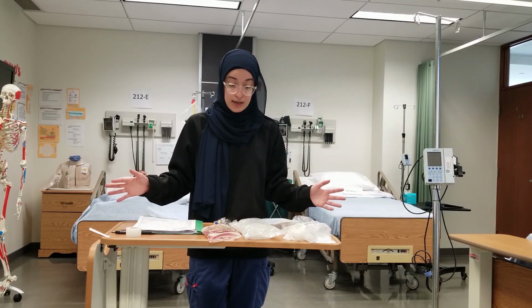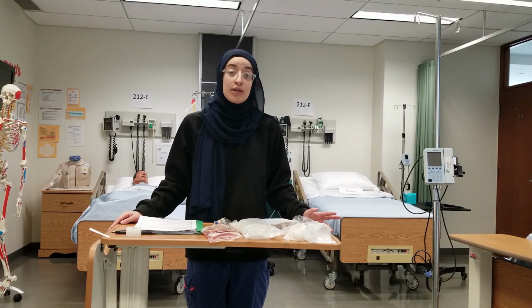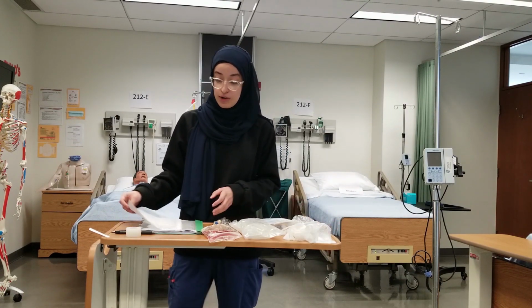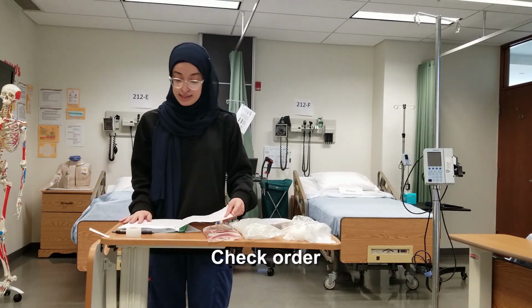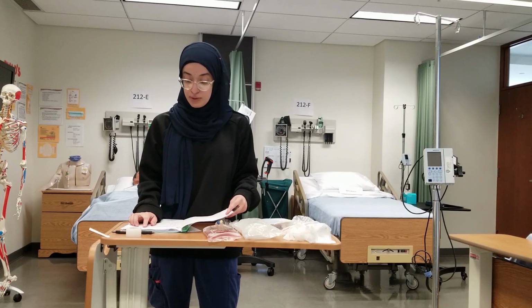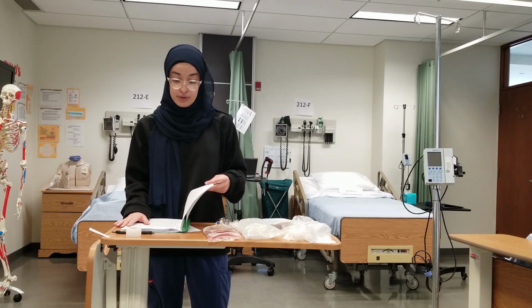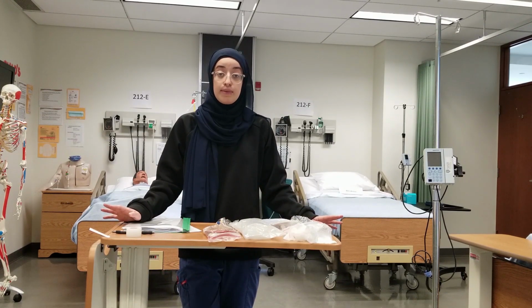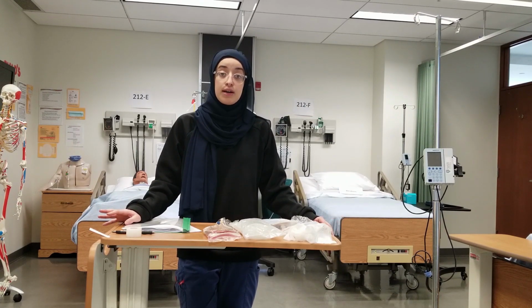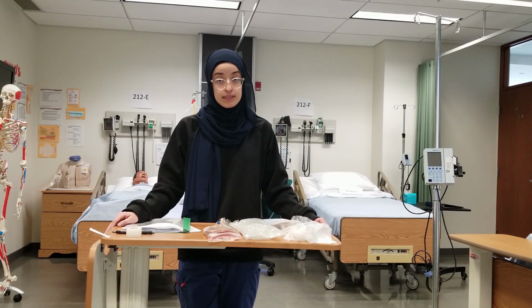Today we have our patient Walter Whitesell, and he is going to receive some blood. I've received my order from my physician right over here in the patient's chart, and it says transfuse 1 unit of packed red blood cells over 2 hours stat, and then to repeat some labs afterwards. So what I'm going to do is cover my math first, and figure out what my rate and my volumes to be infused are. That way I'm able to put it directly into the pump afterwards.